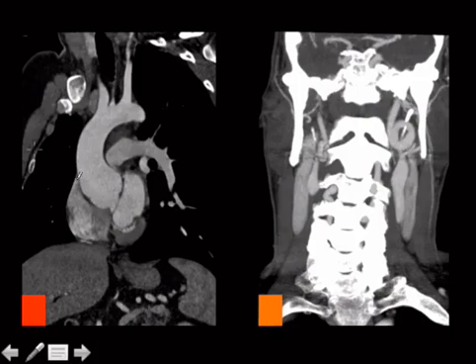So like this part here is bigger than that part here. It's usually the other way around when you see aortic aneurysms. And this is an Aunt Minnie for Marfan's, which you may remember is a defect in the fibrillin gene, which is part of how your collagen works.